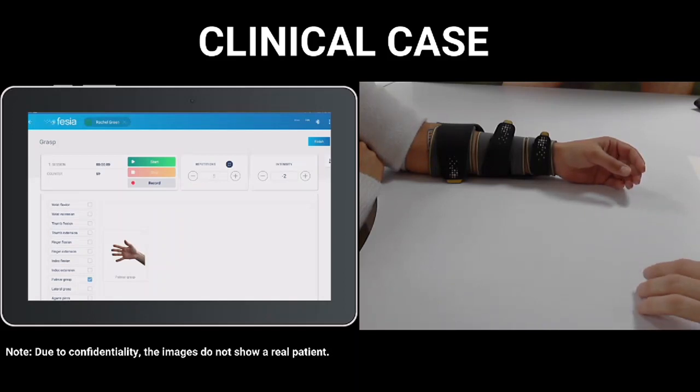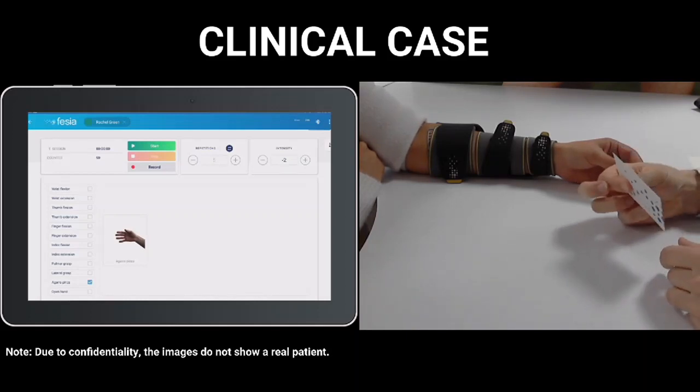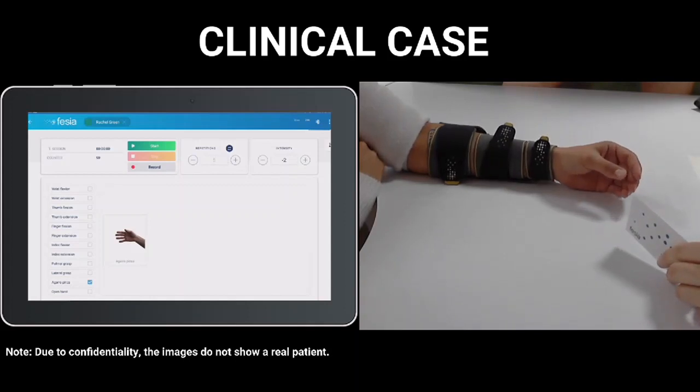going to involve also the pinch, but I want you to increase by your own the flexion contraction. Therefore, I will select the pinch here, and as you already know the times, we are going to repeat the previous exercise, but once you have pinched this object here, I am going to retire it, and you don't have to let me. Okay? Let's start.